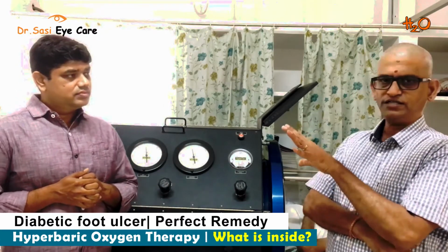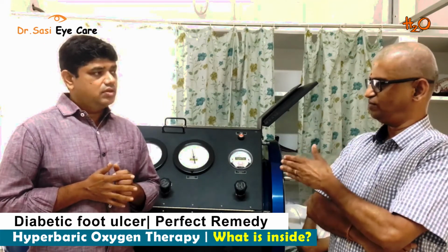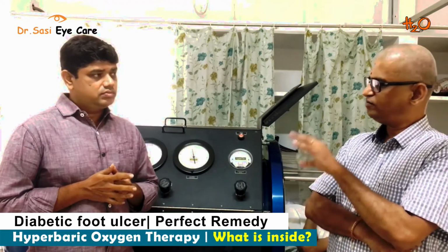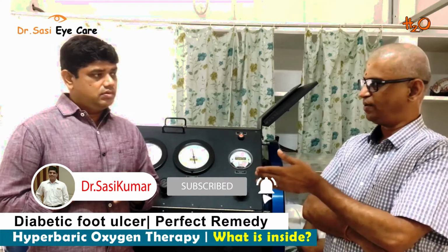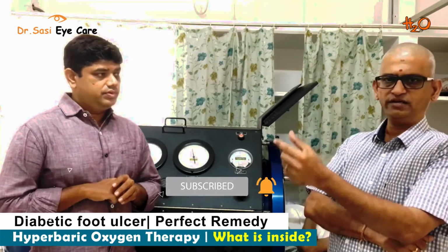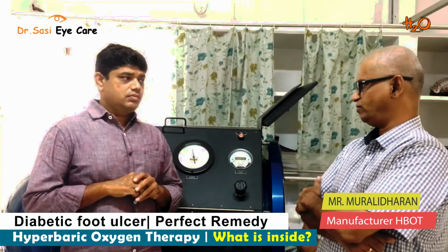When you talk about the indications, there are about 15 indications which are very well approved worldwide by the European Union and UHMS, which is the governing body of hyperbaric oxygen therapy worldwide. They have listed 15 indications. Beyond this, select countries like Australia, China, South Africa, Japan, and Germany have added a few more indications based on the clinical studies and the success they have had. So in all these indications, hyperbaric therapy is very well used.